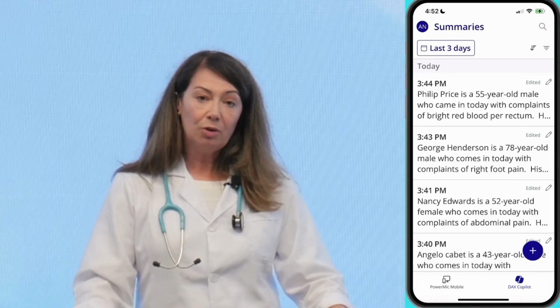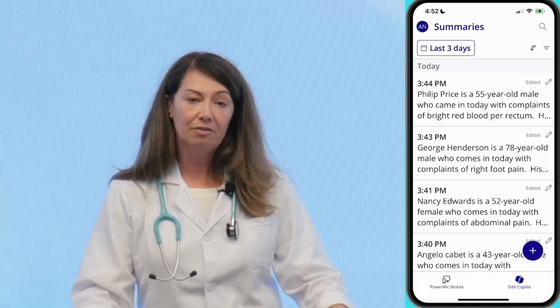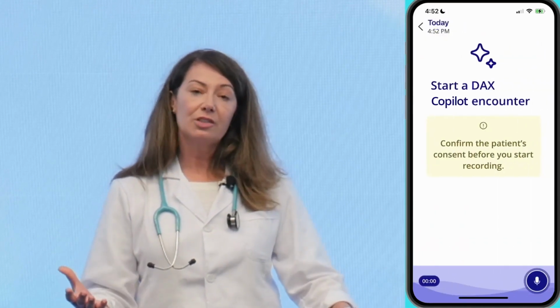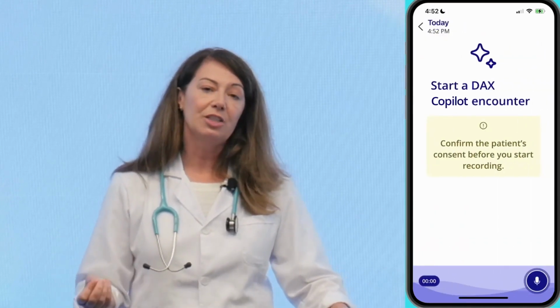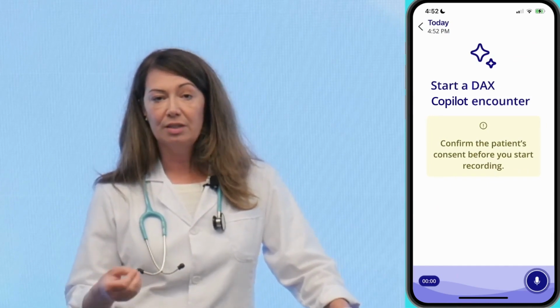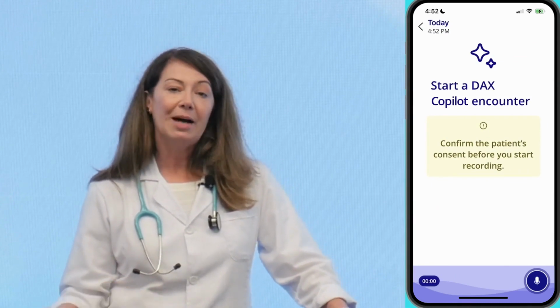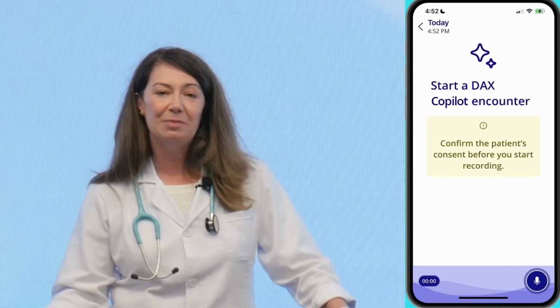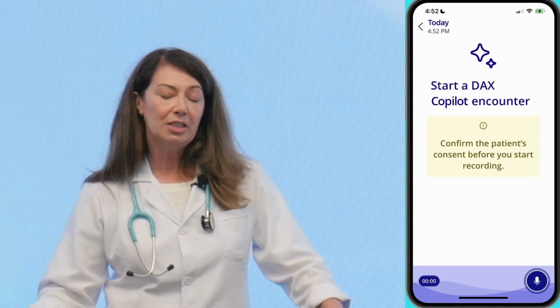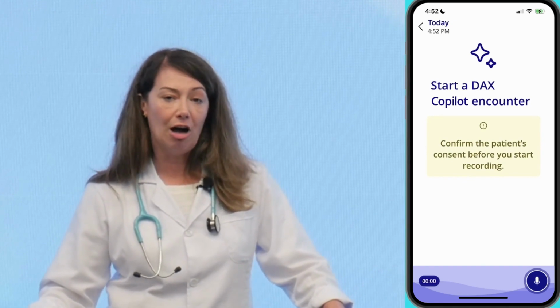Now, to begin the recording, I can go ahead and press the plus button down in the lower side of the mobile application. This takes me to the screen and just makes me aware as a clinician that I need to be sure that I've gotten appropriate consent from the patient in order to use this technology. For the purposes of today's demonstration, my colleague, Caitlin, is going to be the patient. We're going to go through a mock clinical encounter, and she's going to be playing Maria Gonzalez, who's 35 years old, coming in for a cough.